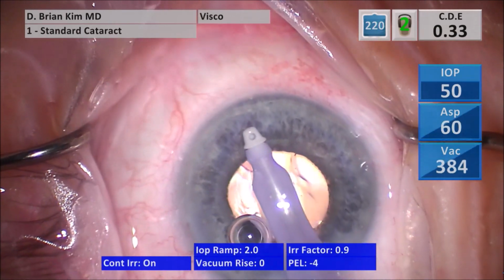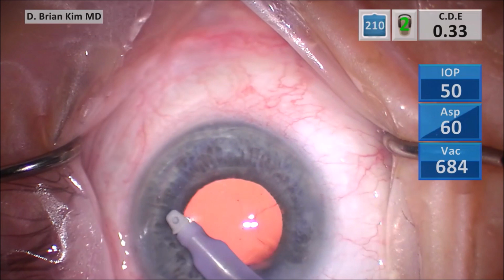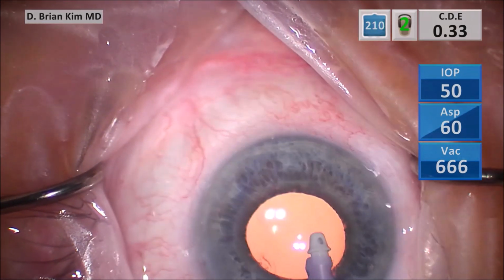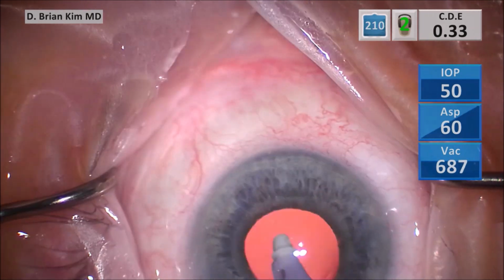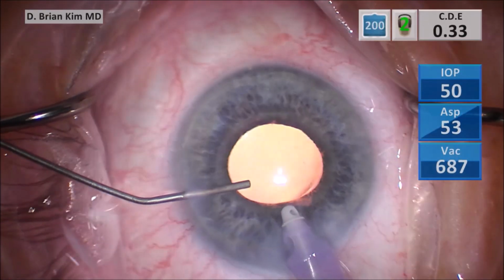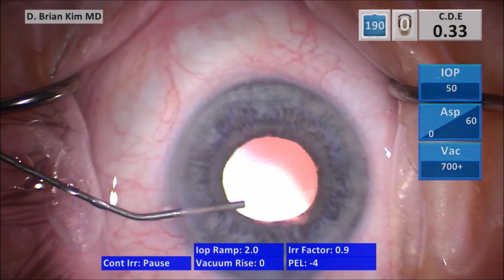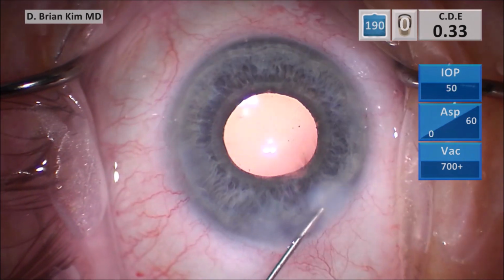So again, this is a case of a fairly small pupil. As you can tell for all of my cases, a small pupil doesn't really change how I do my lens disassembly because I know that with my technique, I'm going underneath the epinuclear material as I slide out. Therefore, I am never over the anterior capsule. Therefore, when I do the chop maneuver, I am not going to cause a zonular dialysis or dehiscence.